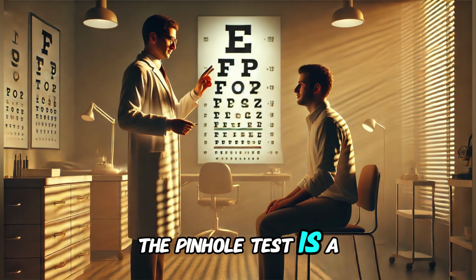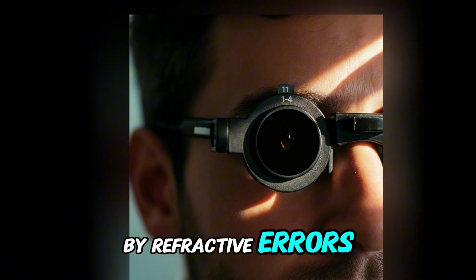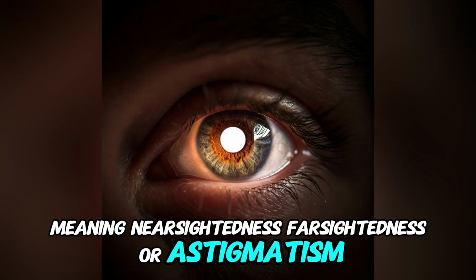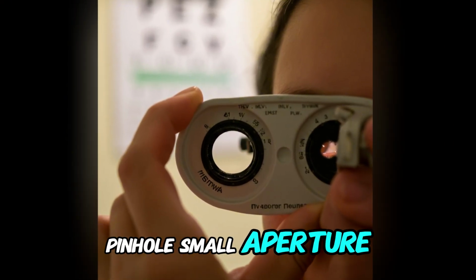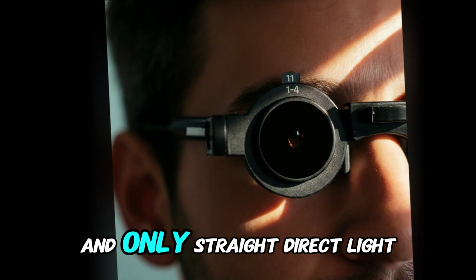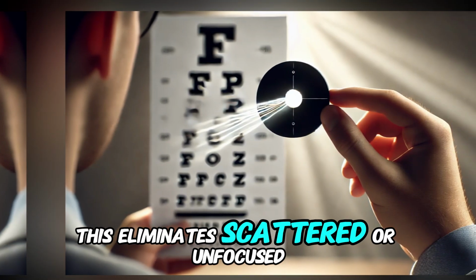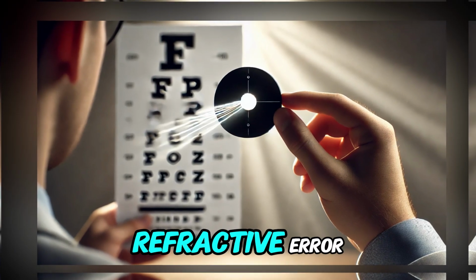The pinhole test is a quick and easy way to check if poor vision is caused by refractive errors, meaning nearsightedness, farsightedness, or astigmatism. When you look through a pinhole, a small aperture, the amount of light entering the eye is reduced and only straight direct light rays pass through. This eliminates scattered or unfocused light, temporarily improving vision if the issue is a refractive error.